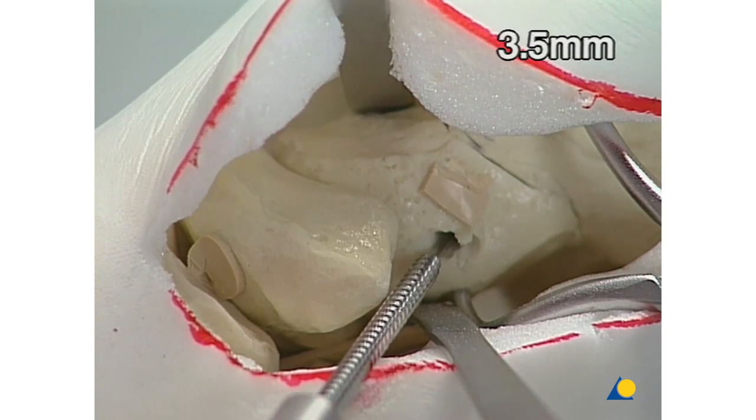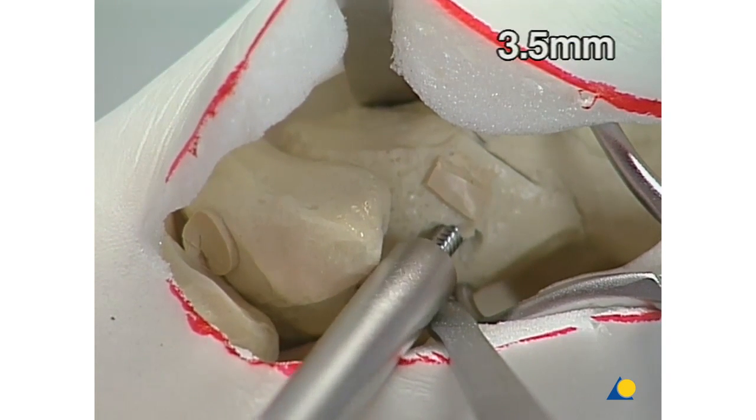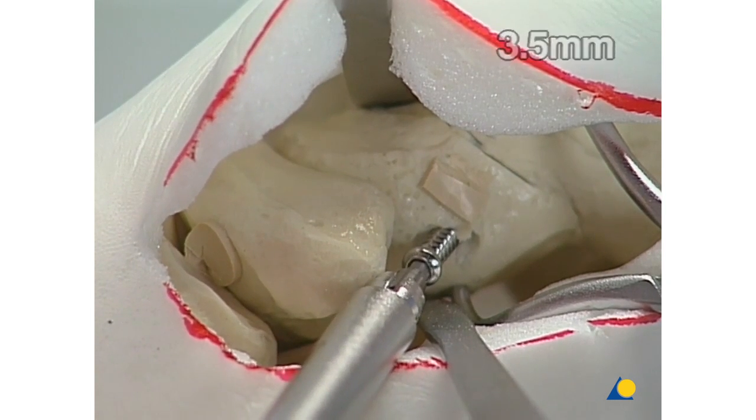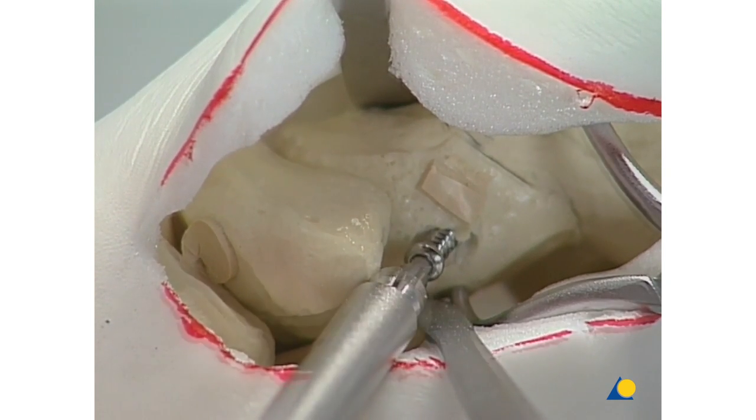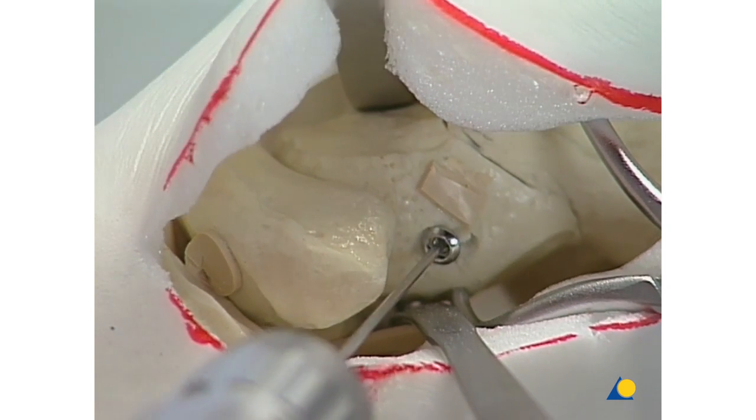Insertion of the 3.5mm cannulated screw. The guide wire is now removed.